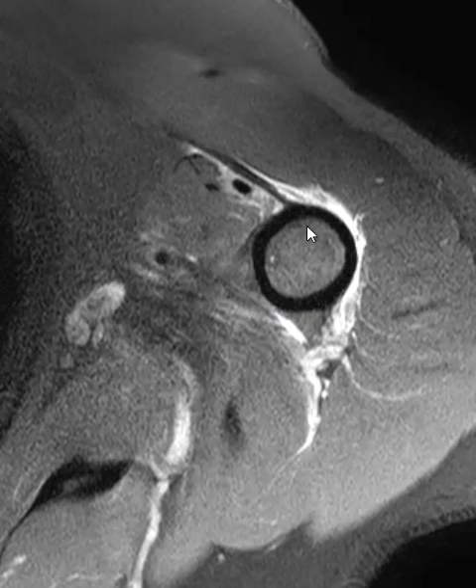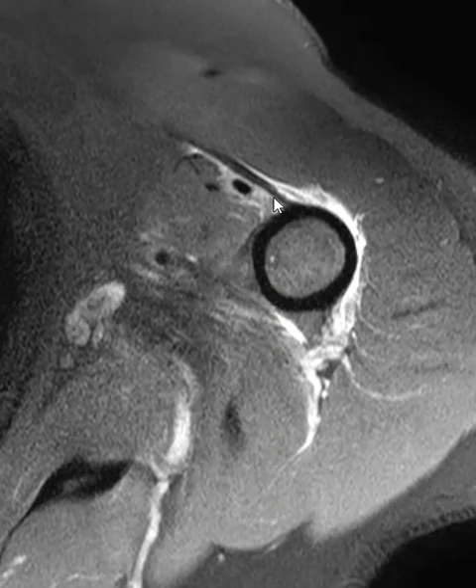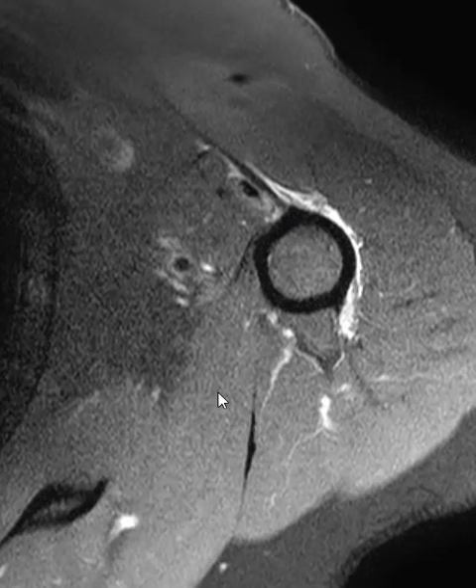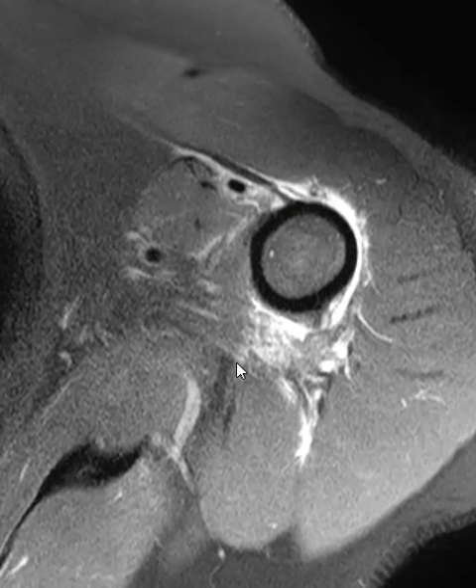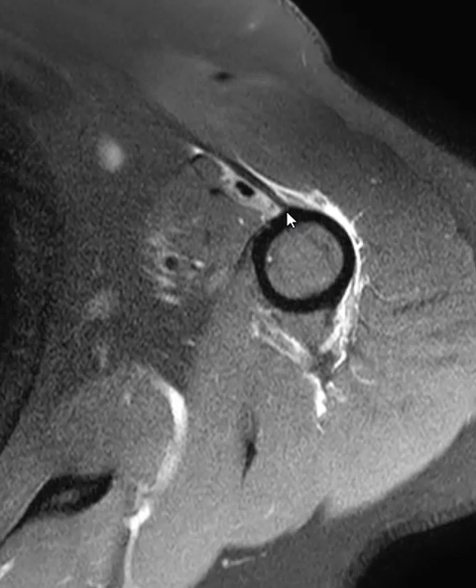Now down lower in the arm here, here's the humeral shaft, and you can see this long structure here. This is the pectoralis major tendon coming down here attaching. I almost never see this — usually when the biceps is intact there's no fluid around here and I really can't discern it very well — but this just happens to catch it just right to see that tendon coming down here to attach on the humerus. You can see how small it looks. We're going to move up and then we're out of it. It's a pretty small attachment, which is surprising for such a big, strong muscle to have such a small tendon and such a limited attachment.